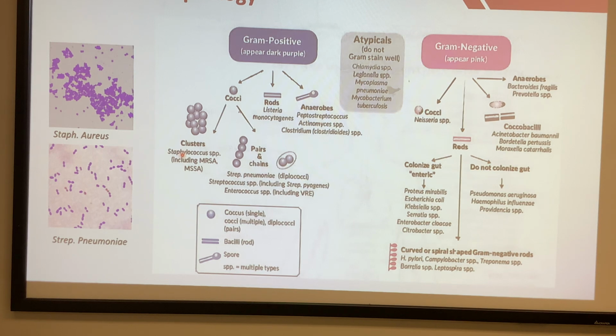So after observing your gram stain, sometimes laboratory scientists would already have a brief idea of what they are handling, okay? So that is very important. And here, if you have gram-negative, a lot of times the rods are more important for gram-negative microbes. And for the ones that aren't listed here, such as the curved ones, you can read this list later on and make sure you're familiar with it. I won't go into detail about every single one of them.